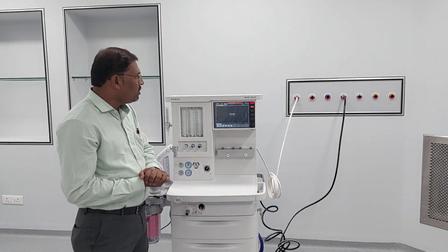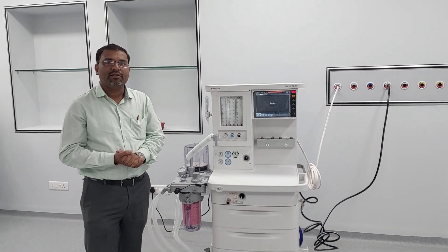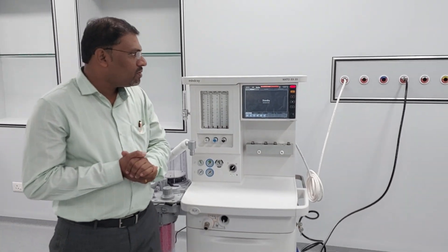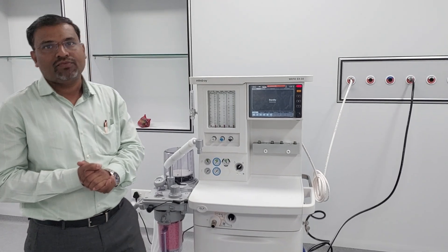Today we are going to make a video on how to calibrate the flow sensor on the Mindray WATO EX-35 machine. The basic function of the flow sensor in an anesthesia machine or ventilator is to measure the flow.